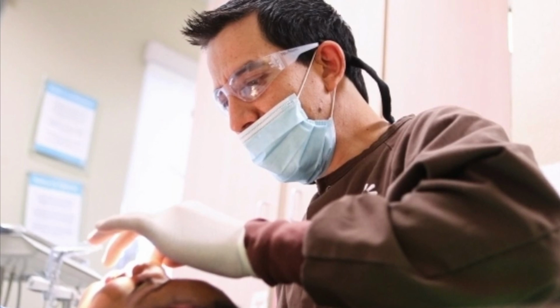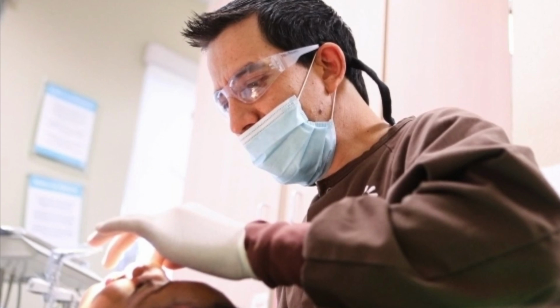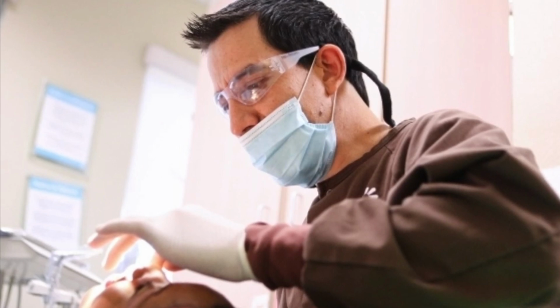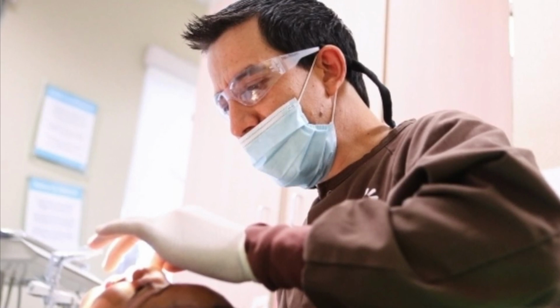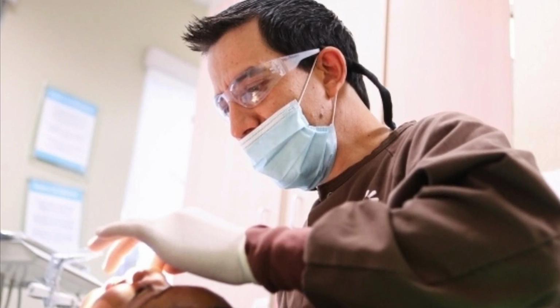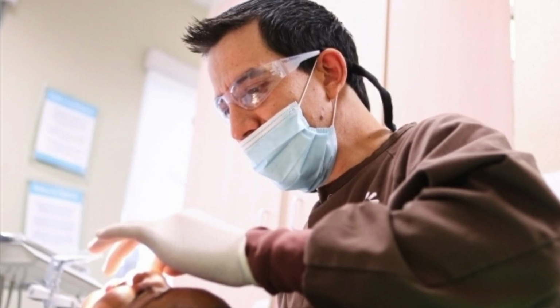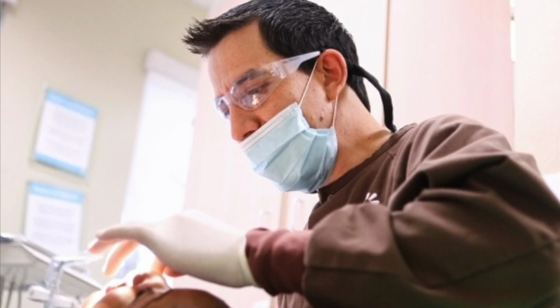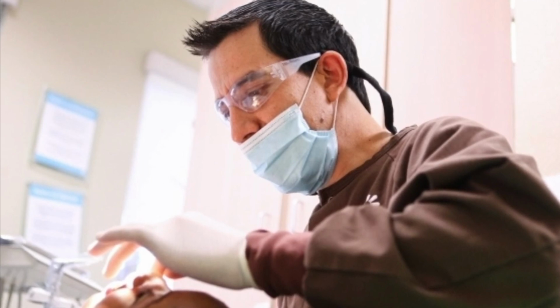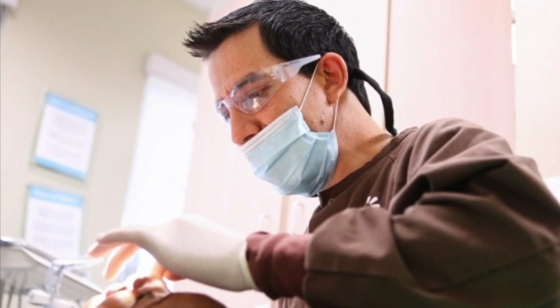Filing action is a push-pull action without rotation, which has a greater efficiency with files than reamers. The cross-sectional appearance of the prepared root canal is irregular with a general oval configuration, so the canal must be filled with gutta percha.